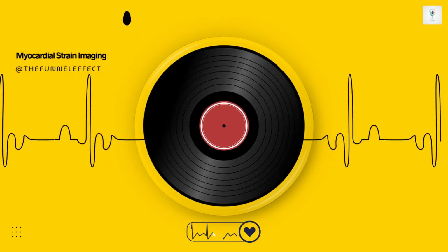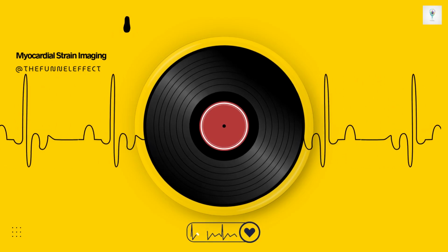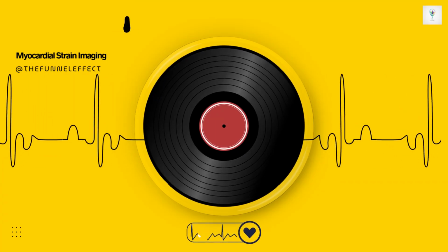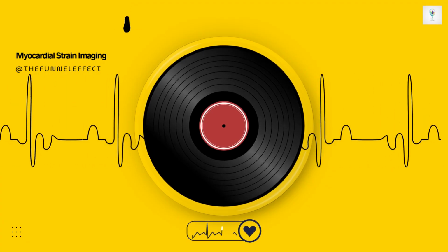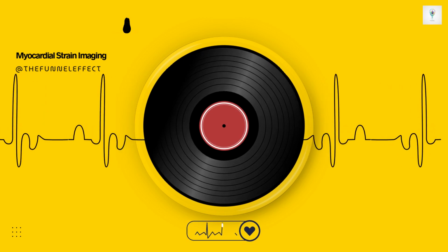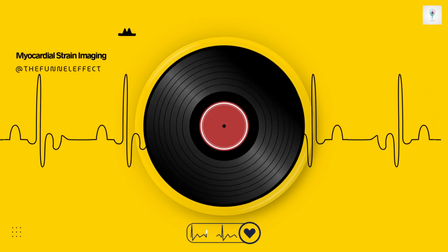Got it. Okay, let's think in three dimensions. The heart muscle doesn't just shorten one way. It shortens, it kind of cinches in, and it thickens. So we need measurements for all three. That's right. These are the three orthogonal normal strains of the left ventricle, the main pumping chamber. First, there's longitudinal shortening. This runs along the long axis, from the base to the apex of the heart. And this is the one that gives us GLS. Correct. This is the one we prioritize clinically, leading to global longitudinal strain.